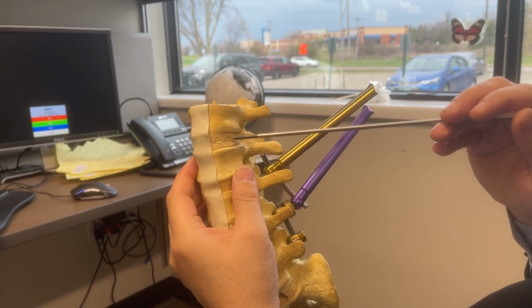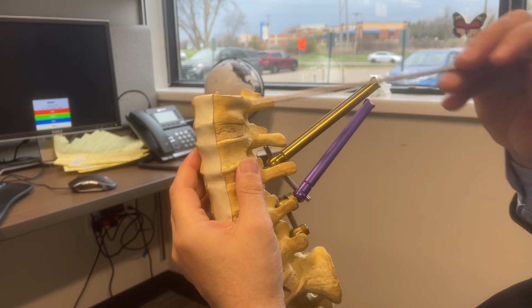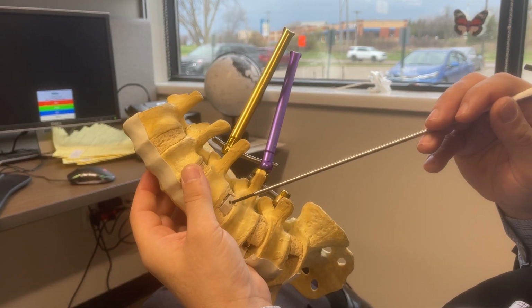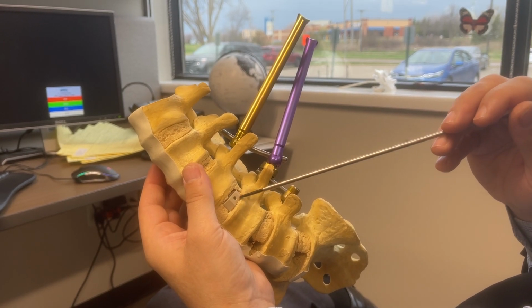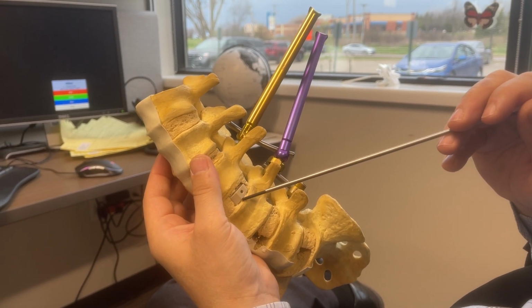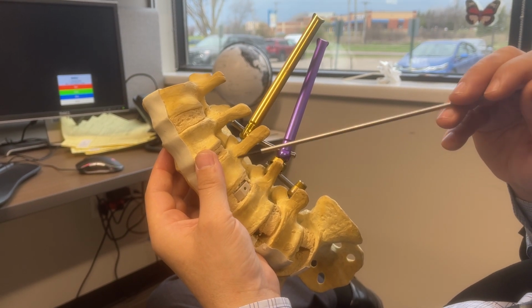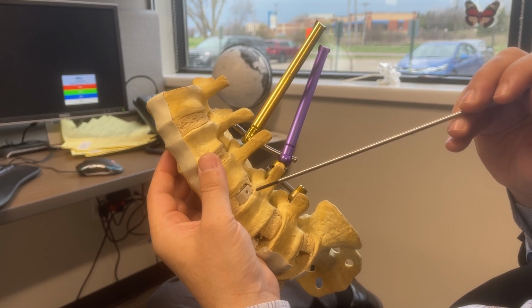But it's important to know this surgery, the prone is a prone lateral, meaning the patient is prone. I don't have to put the patient on the side, and certainly the profile of the disc is not like a regular XLIF or lateral disc, meaning that I don't have to have a huge opening that impedes with all the lumbosacral plexus here.